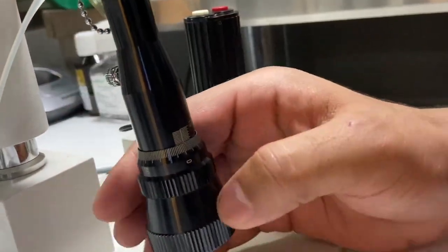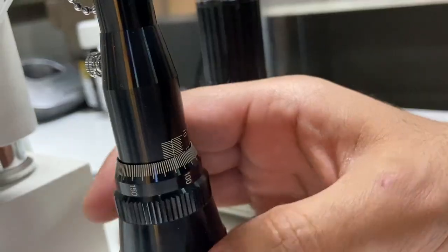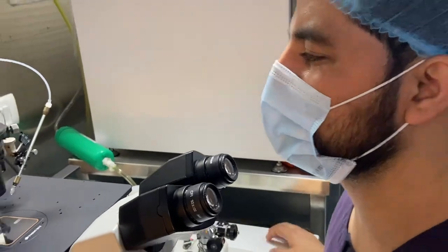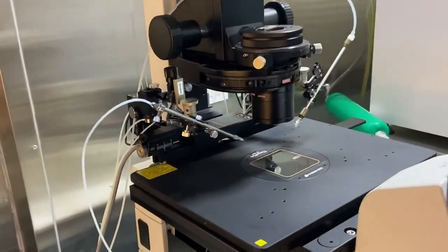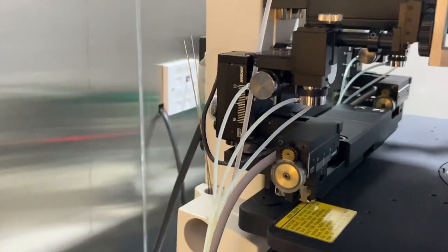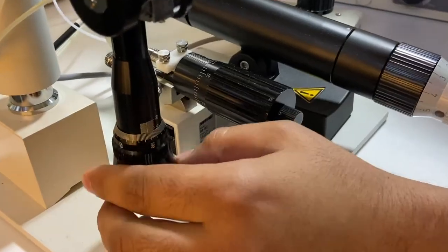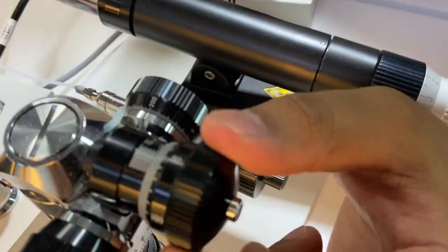Similarly, if you check this alignment, this is used for fine focusing during the tip, so I will also keep it around 5. You can see now 5 is visible clearly. That means it's neutral. We can use the same procedure for the holding side. Everything should be on the 0. This is a little up, so I am getting it down. Now this machine is on the 0. I will also check the status of its fine focusing, which is a little down, so I will keep it at 5. Similarly here, it is towards my side, so I will keep it around 5.